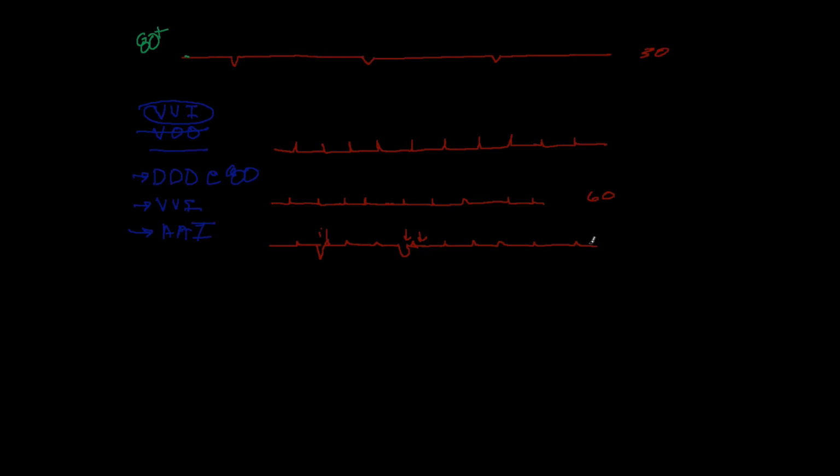Sometimes if doing that does not remedy the situation, sometimes just batteries at the end of their lives can do this, and these are just simple 9-volt batteries in the pacemaker. Best thing to do is just get another box and pop it in place while you figure out what's going on with the battery of your first box.